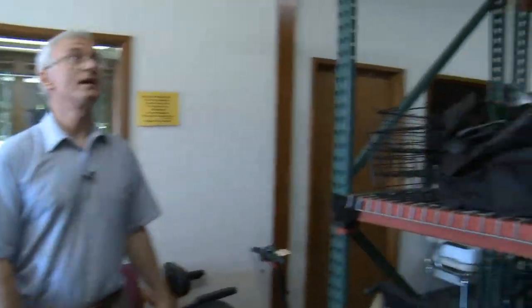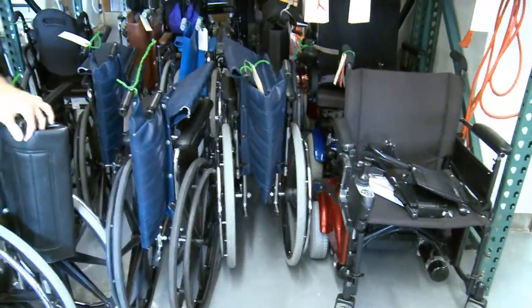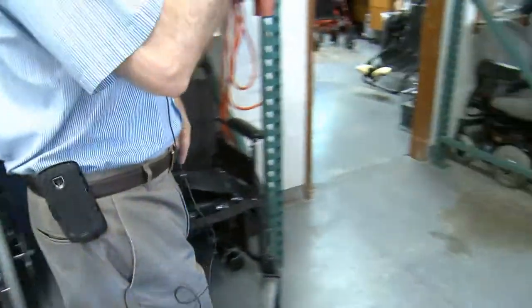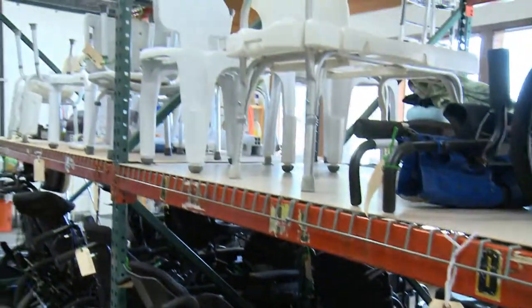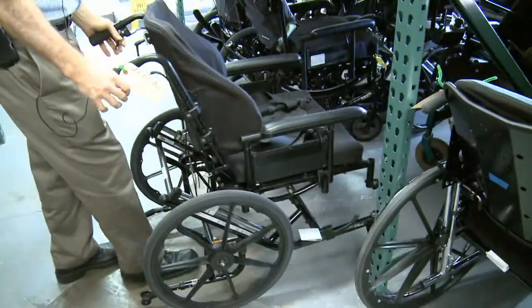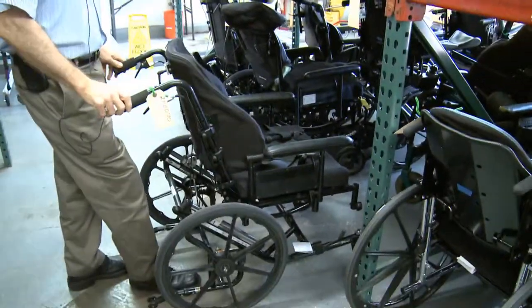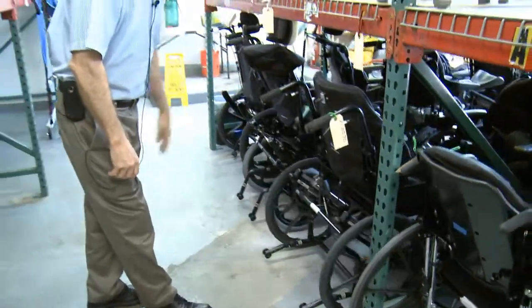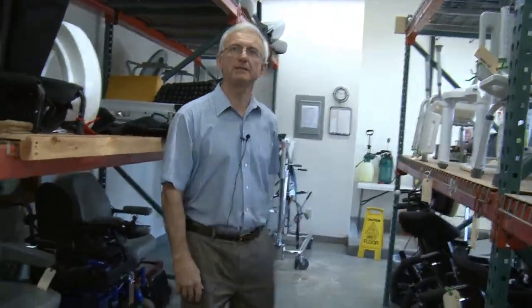We try to keep things in particular areas: wheelchairs go here, just the folding wheelchairs. We have four-wheel walkers that we keep down below, bathing equipment up there. Down here we have specialty wheelchairs — tilt-in-space wheelchairs — which are more valuable but don't move as fast. We just try to keep a range of as many things as we can.